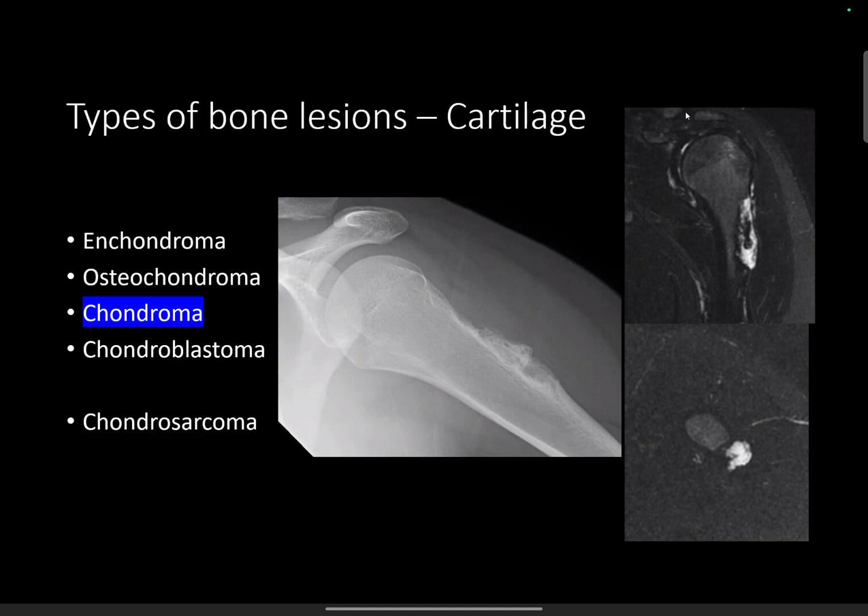They say that the radiologic appearance of bone lesions is very important for them when they're considering the diagnoses. I think the pathologists are really good with benign and malignant, but when you deal with some benign lesions, it's very hard for them to come down really hard on a certain lesion, so the imaging appearance is very important. So yeah, it's a discussion that you have to have.